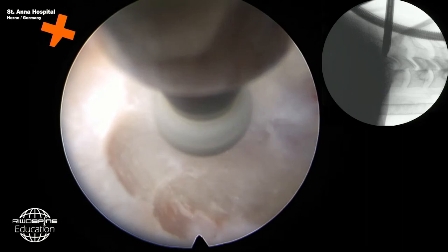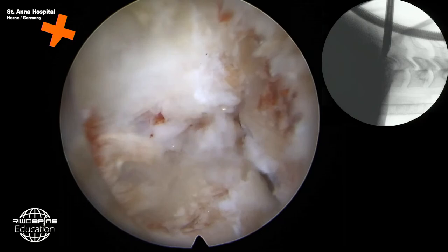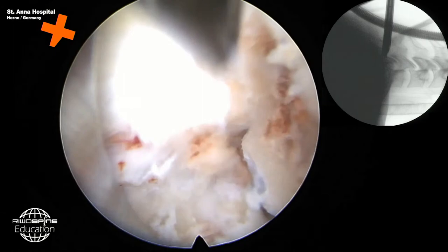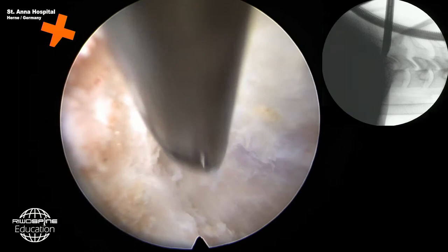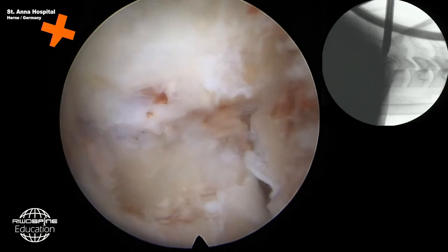Okay, so bone work should be done. The fine rongeur once more. So we thinned the bone here at the ascending facet, caudal lamina, descending facet, and cranial lamina. The next step is now to open the spinal canal.